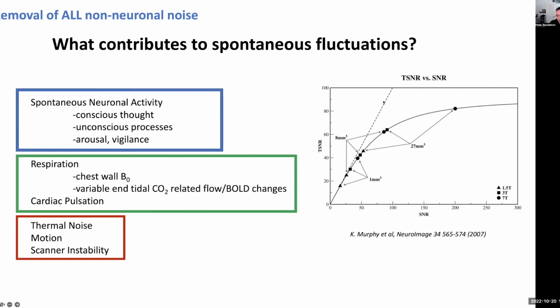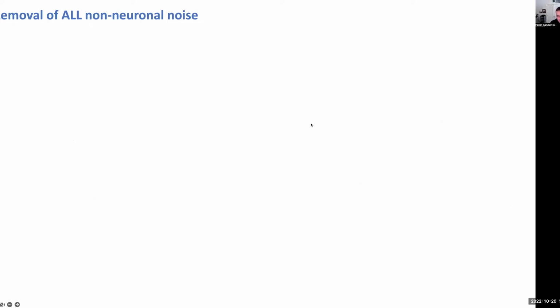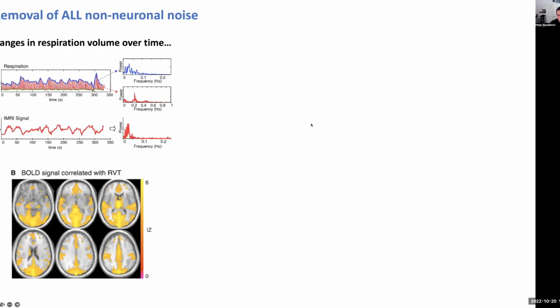So we would like to have it such that these curves are aligned, so that the goal then is that we can have RF coils that give you image signal to noise of 1,000 to 1. It'd be nice to have 1,000 to 1 temporal signal to noise to pull out all kinds of subtle things if we just get a handle on our physiologic fluctuations. So that's a challenge. It's worth doing.